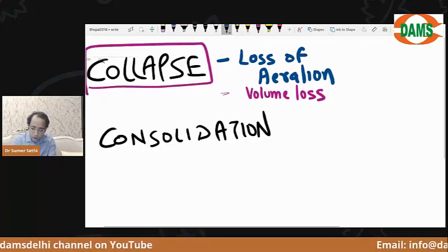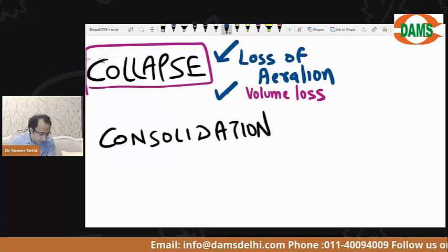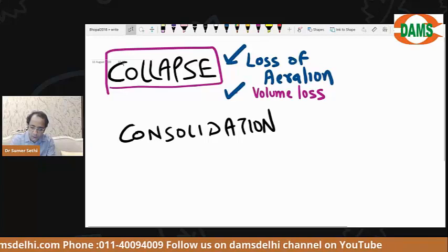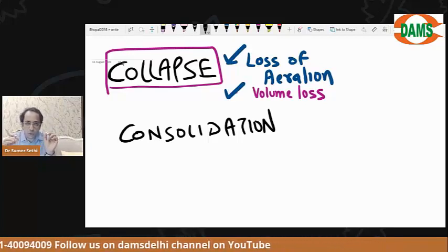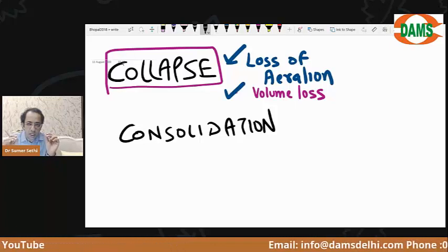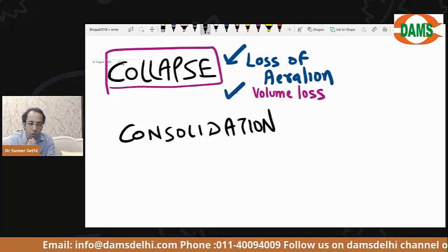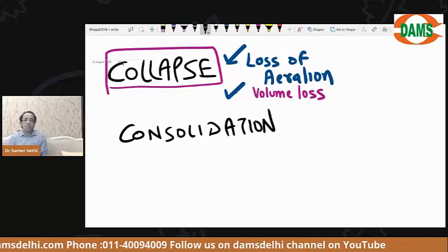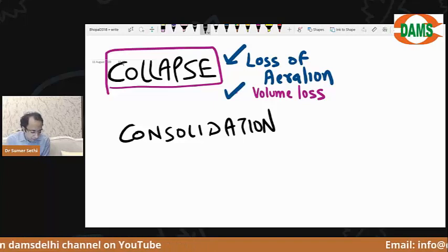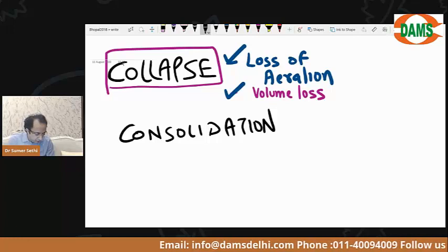Okay, everybody follows? Now tell me, beta, let's see if you can answer. It is just like I want you to imagine a truck tire has punctured. What will happen? Loss of air, loss of volume, collapse. Now tell me from your basic understanding, why would collapse happen in a chest film?